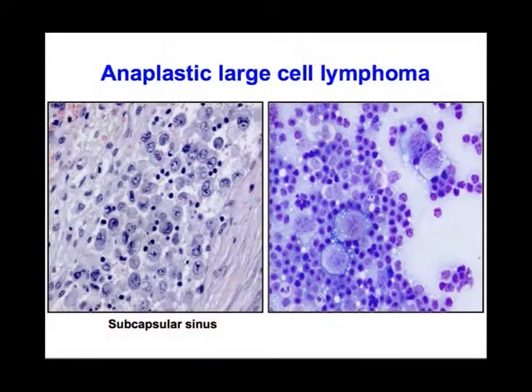It is a T-cell disease, as you know. It very, or not uncommonly, does not express CD3. It can express other T-cell markers, typically cytotoxic, can be EMA positive depending on where you live and how you stain, and ALK positive, of course, is characteristic. It's characterized as clonal, of course. There are a few exceptions, and the typical cases have a 2;5 translocation, but remember the presence of a variant translocation will give you differential staining with ALK, where it's not nuclear, it can be different. I took those slides out in the interest of time.